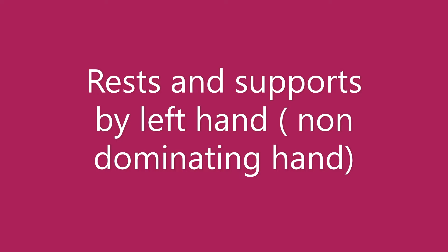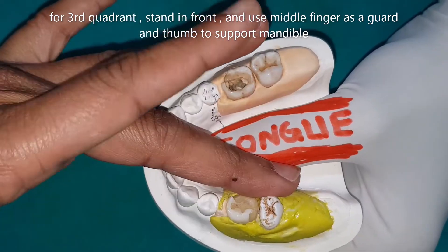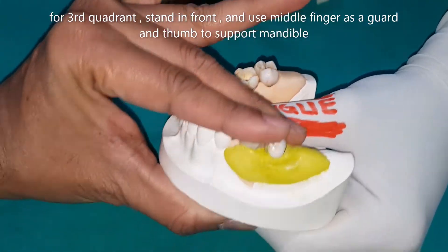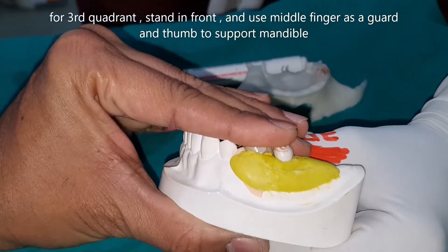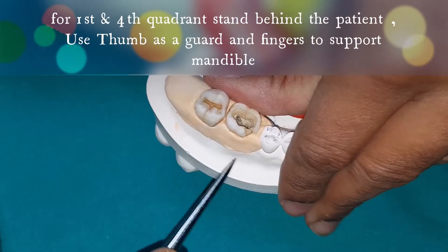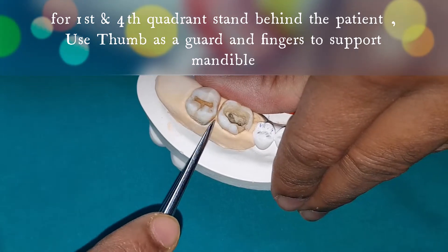Rest and support by the left hand is very important. If you are working on the third quadrant, place your middle finger lingually to the tooth to be elevated, index finger on the occlusal plane, and thumb holding the mandible. If working on the fourth quadrant, keep your thumb lingually and fingers circling the mandible.